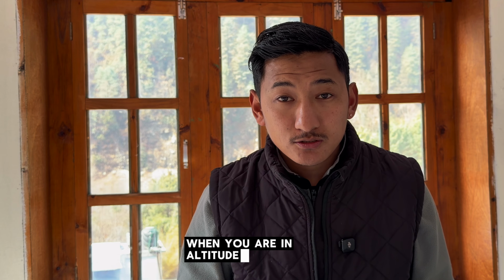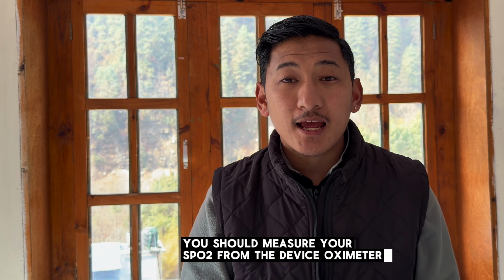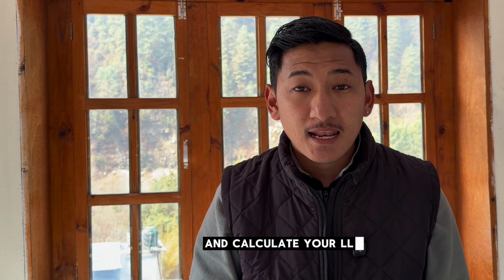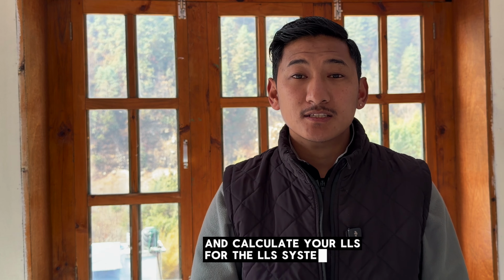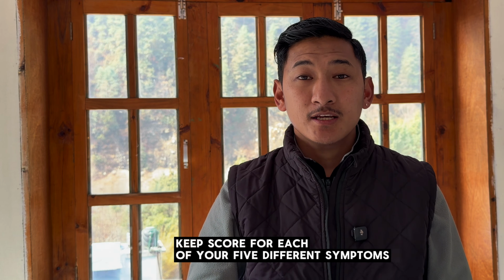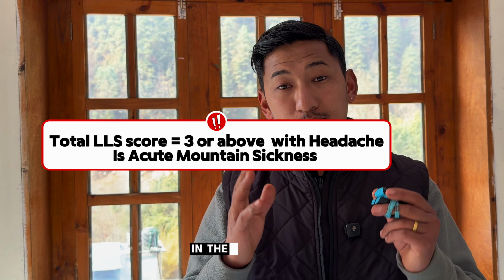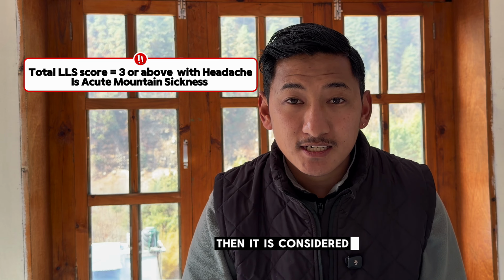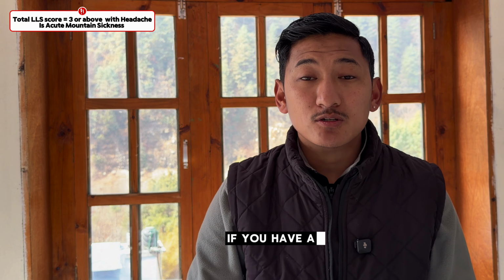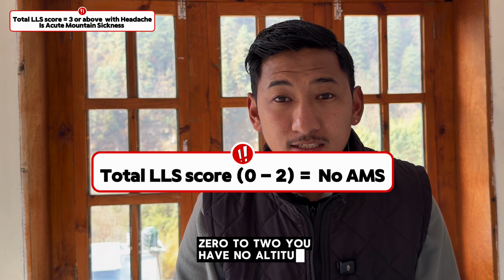When you are trekking or climbing at altitude, you should measure your SpO₂ from the oximeter and calculate your LLS. For the LLS system, you should keep score for each of your 5 different symptoms. If the total addition of your symptoms is 3 or more in the presence of headache, then it is considered as AMS. If you have a total LLS score of 0 to 2, you have no altitude sickness.